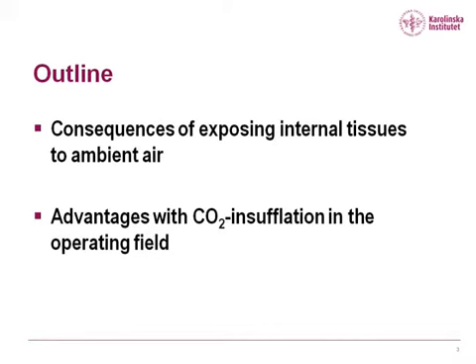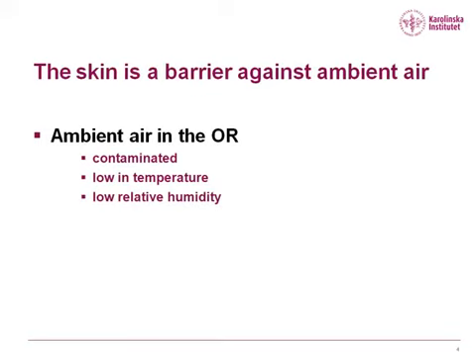I will talk about the consequences of exposing internal tissues to ambient air and the advantages with CO2 insufflation in the operating field. The skin is a barrier against ambient air. Ambient air in the OR can be contaminated. It's lower in temperature than the body and has a low relative humidity.